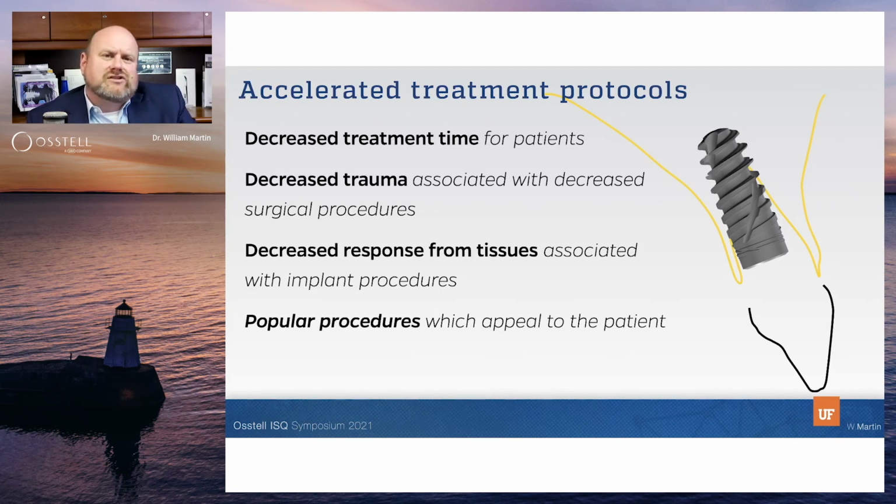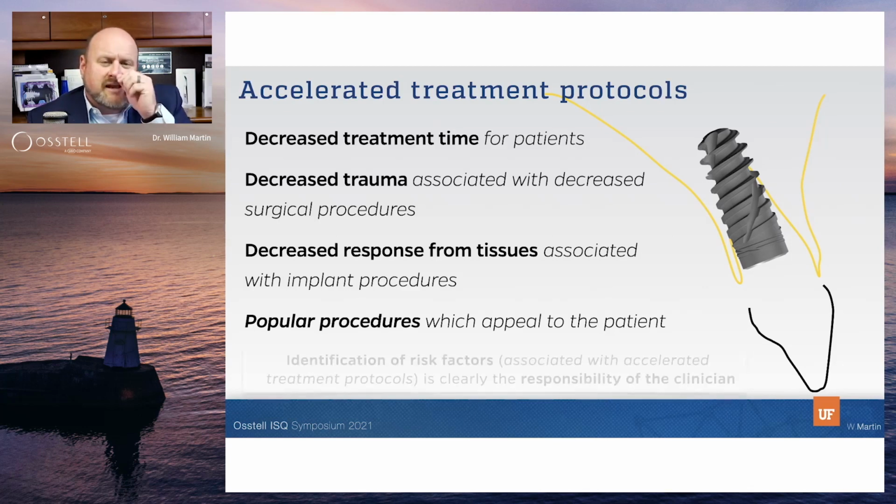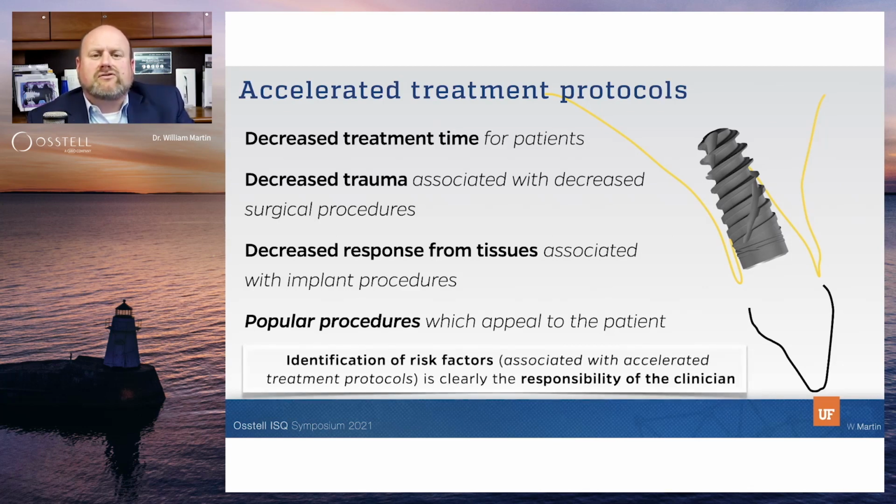Where are the advantages to this? Well, we have decreased treatment time for patients, decreased trauma for our patients, which then I think leads to better response from the tissues. And patients are much more appreciative when they can have a tooth in place or they can get to a tooth faster. But it's up to the clinician to identify these patients and if they're good candidates for this type of treatment protocol.